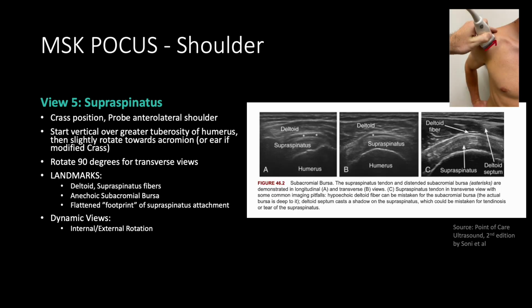And then we're jumping on to our other anterior approach, or anterior view. Although this says view 5, I know it's only the third one we've seen. That's because I'm presenting these in the order that I typically ultrasound them. And so this is looking at our supraspinatus tendon.